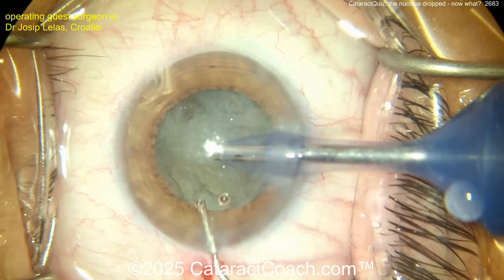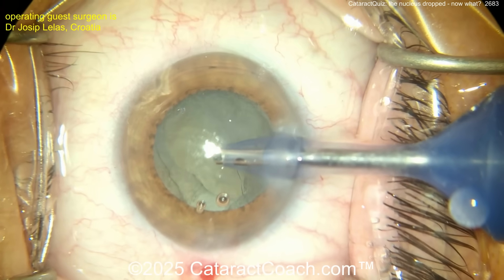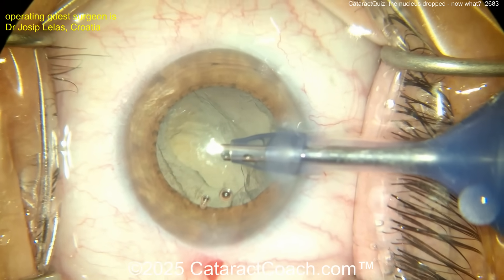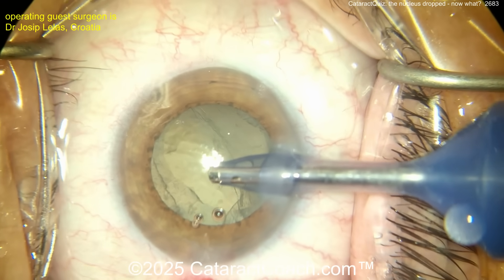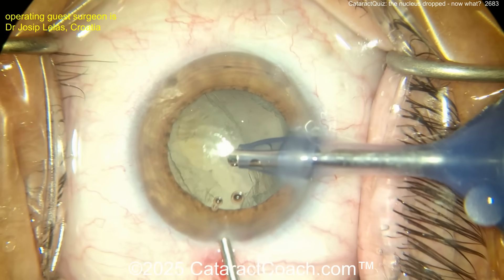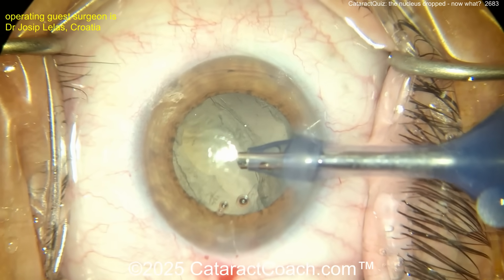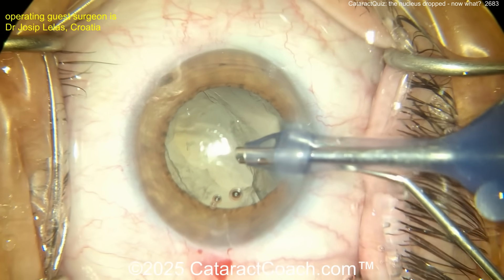Inject triamcinolone — good idea. Let's see how much vitreous prolapse there is. I don't think there's too much. Just put a little viscoelastic there to tamponade, then refer to your vitreoretinal colleague. Should you put a lens in? You could clean up the whole anterior segment and put the lens in, but if you have a great vitreoretinal colleague, you could also just send the patient to them aphakic — suture the main incision, tell them the correct power lens for the sulcus — and let the retinal surgeon do the pars plana vitrectomy and pars plana lensectomy.